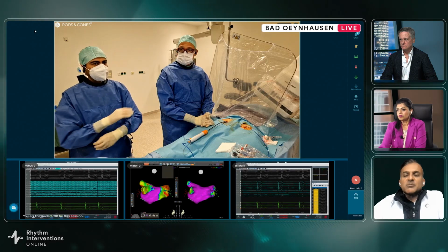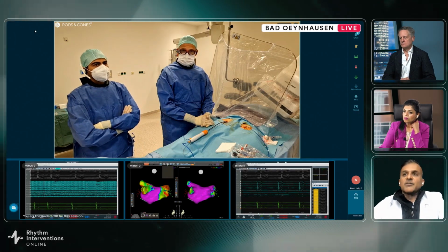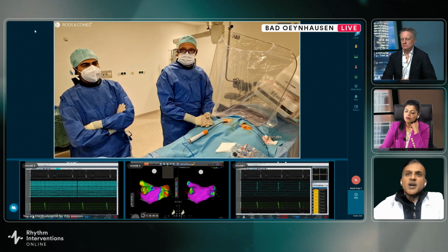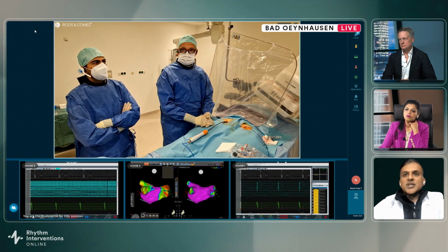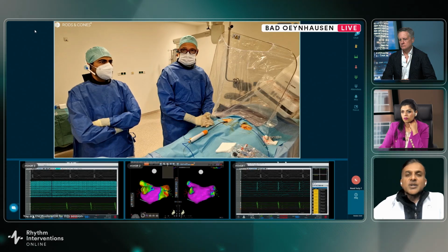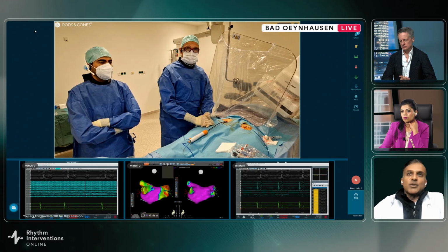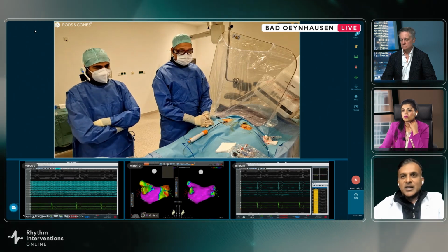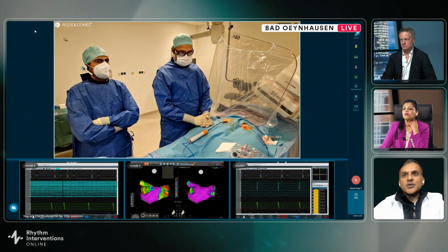In the United States, putting ICE in the left atrium gives you great images, but you wouldn't need to put ICE in the left atrium with this system because you can utilize the system's ability for contact. And I think contact is very important both for efficacy and for safety, to make, like Devi mentioned, every lesion count. You won't need to give extra lesions, which decreases the risk of hemolysis, but also improves the chance of durability. So I think it's an extraordinarily efficient technology for paroxysmal AFib.